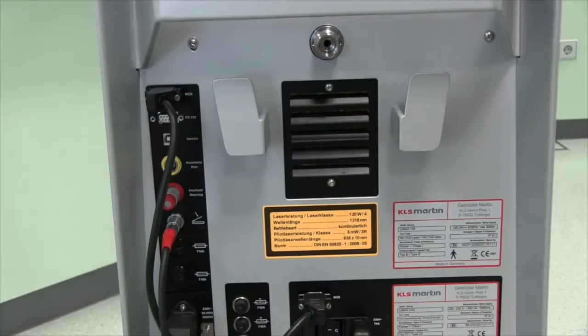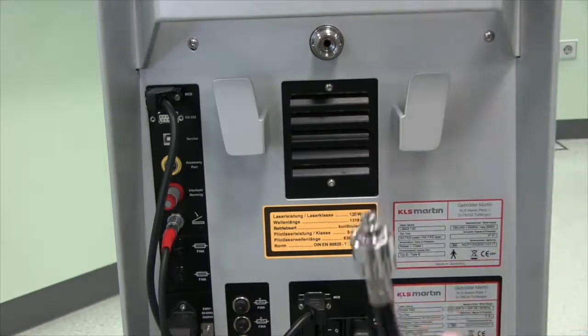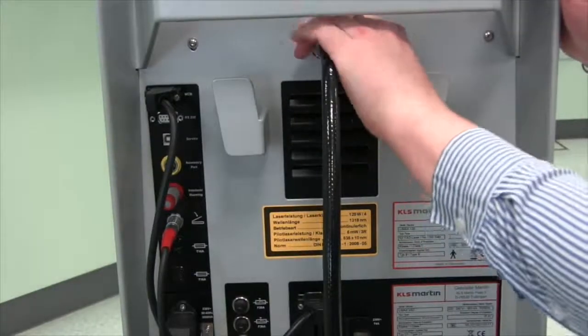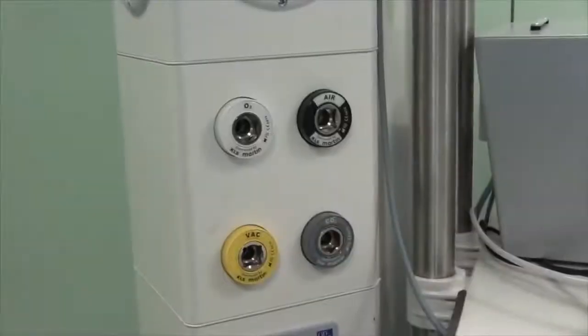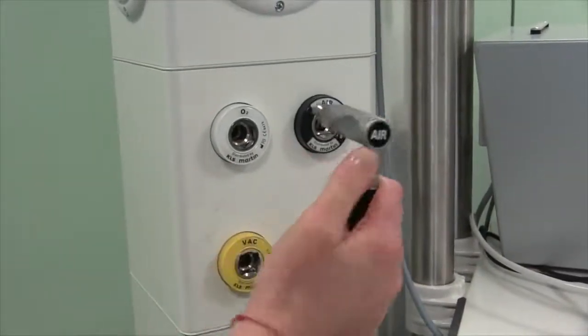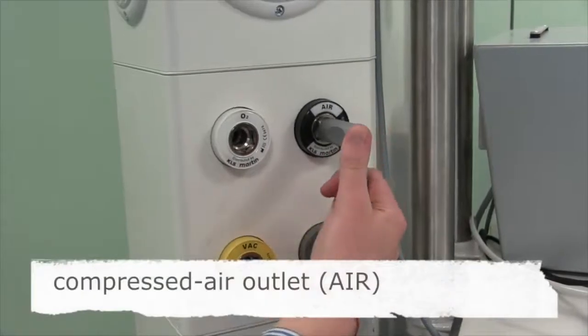If you use the integrated gas purge with the focusing handpiece or the gas irrigated laser fiber, one end of the air hose must be plugged in the NIST socket of the laser. The other end of the air hose is connected to the compressed air outlet, air.